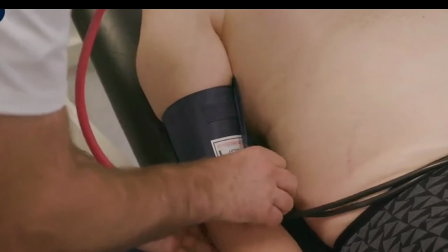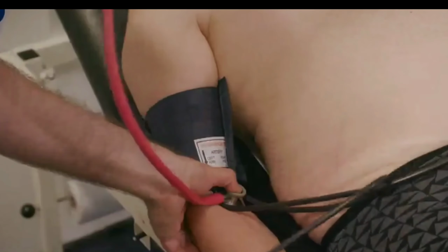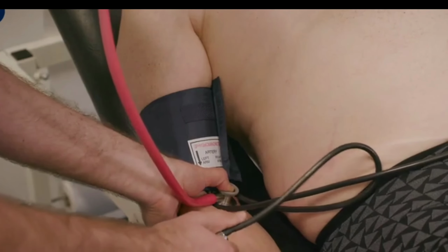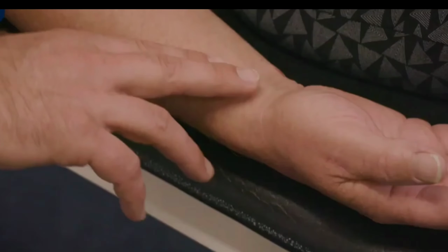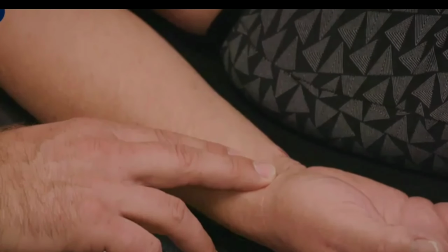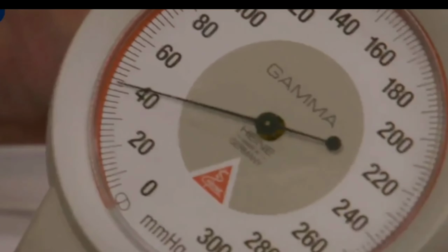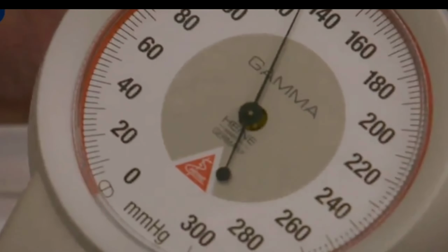The diaphragm of the stethoscope is positioned over the artery and the cuff is inflated above the predicted systolic blood pressure. It can be helpful to estimate the systolic pressure first by palpating the radial pulse while inflating the cuff up until the point that the pulse is no longer palpable. The cuff is inflated to about 20 to 30 millimeters of mercury above the predicted systolic blood pressure.